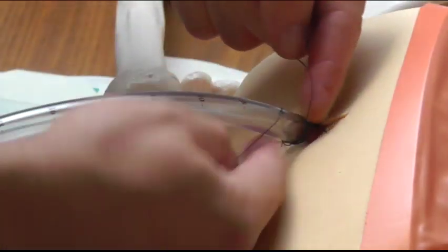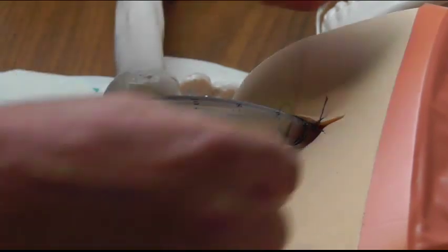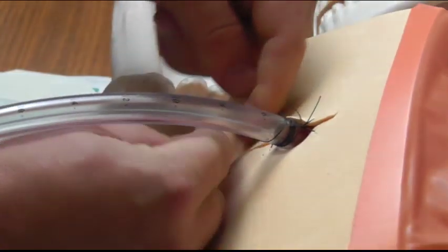It's raised up a little bit. Like I said, it's artificial because it's this rubber material. Actual skin will smooth around the tube much more nicely. And then, like I said, don't Roman sandal it. You want to go round and round fairly close to the skin. It doesn't have to be totally flush, but fairly close to the skin. Leave yourself enough room to do some ties.